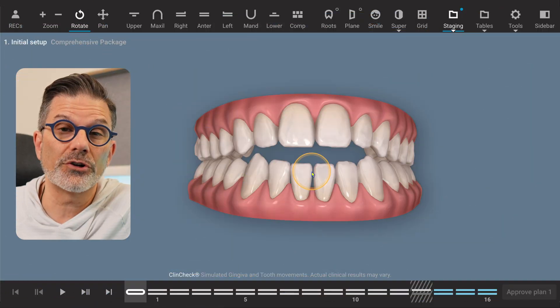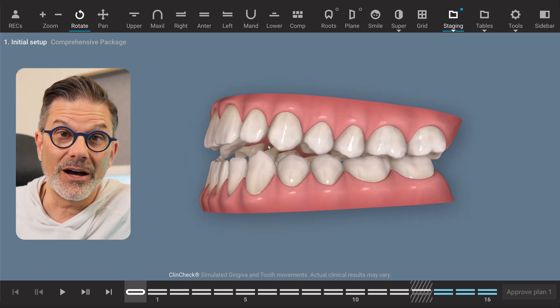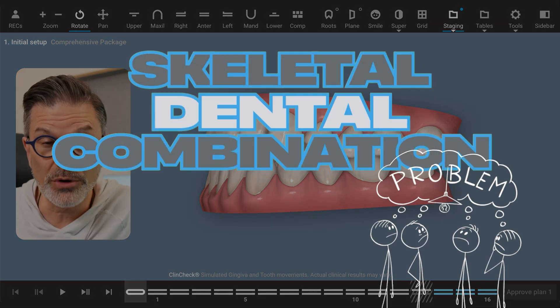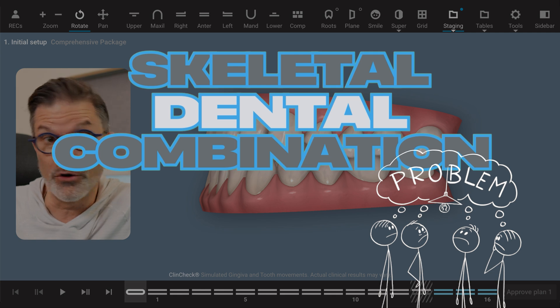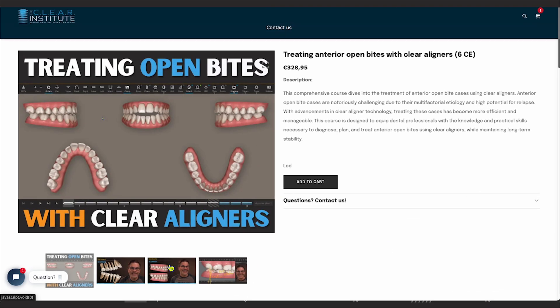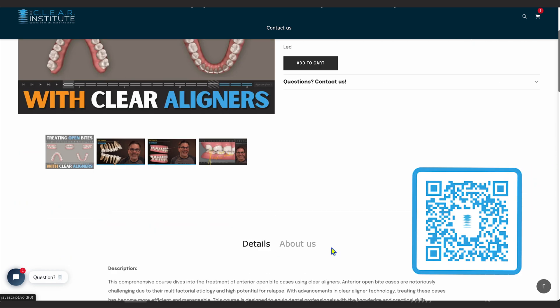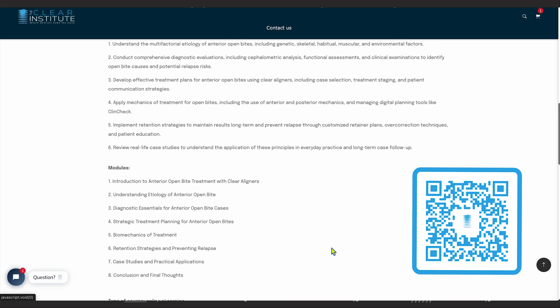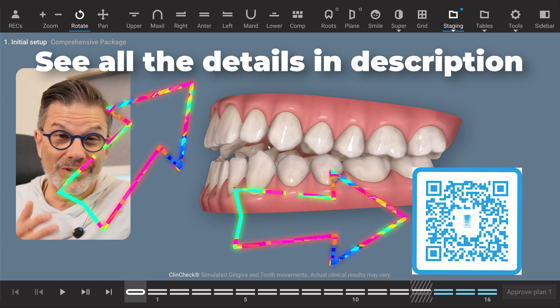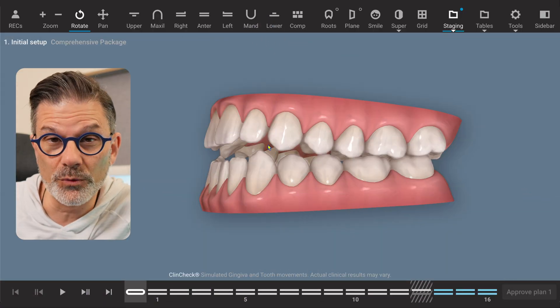This is an anterior open bite case. Usually with anterior open bite cases, we have to determine first: is it a skeletal problem, is it a dental problem, or a combination of both? By the way, if you're looking for a great course on anterior open bite, we have an online course that is really complete — the feedback we get from this course is just incredible. So we have to figure out what the treatment planning will be. Will we go with orthognathic surgery? It's always a possibility, but let's remove that for the purpose of the case here.